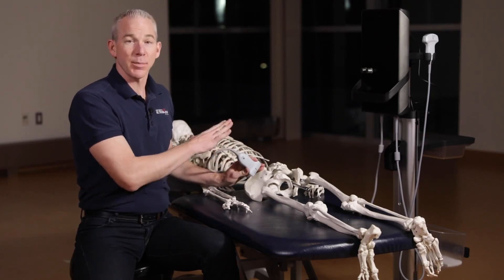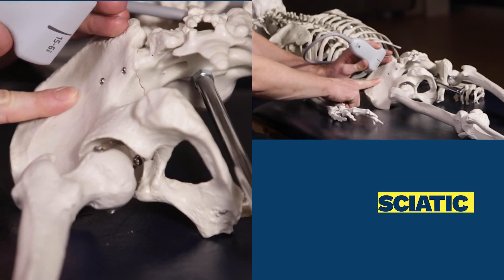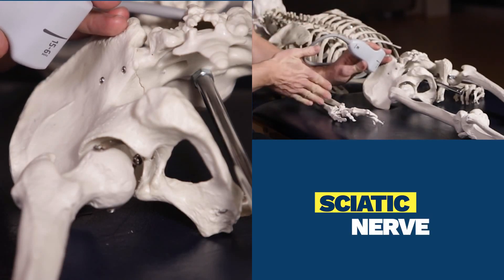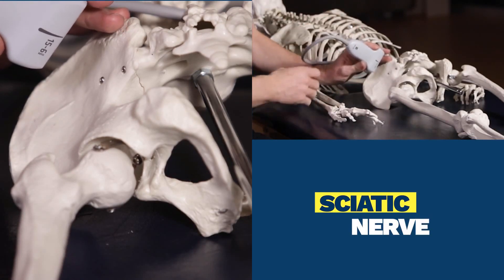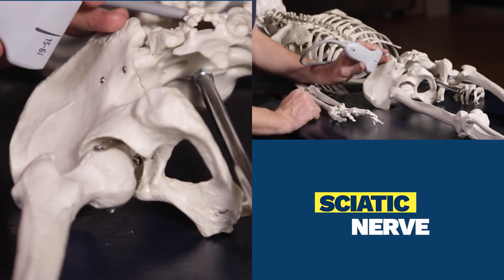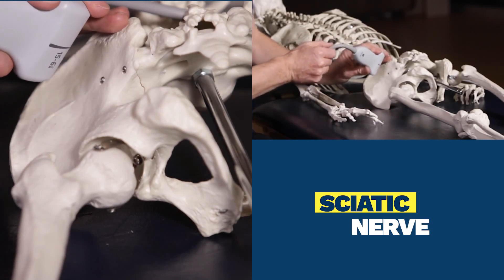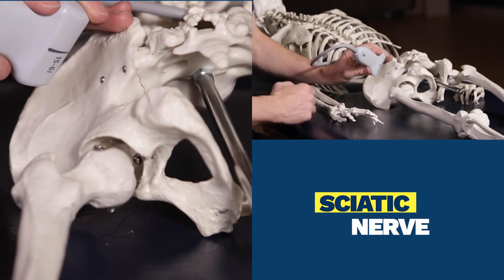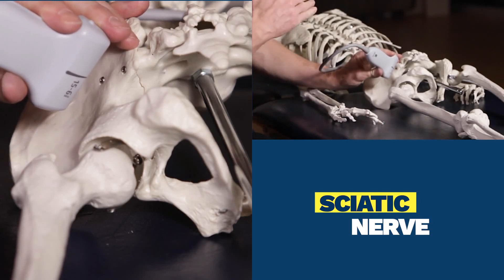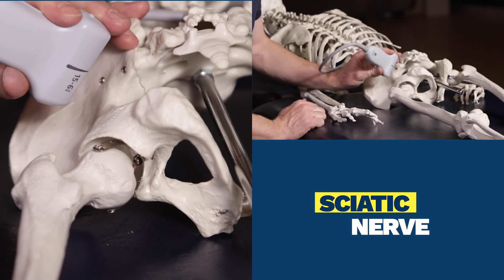The patient position is going to be prone. The landmark is going to be the posterior ilium. The probe orientation is going to be transverse and the angle is quite steep. You can see we're looking at the bony ilium. The movements of the probe are simply going to be angled a bit superiorly and then we're going to move inferiorly until the ilium breaks or falls away — that's the location of the greater sciatic notch.